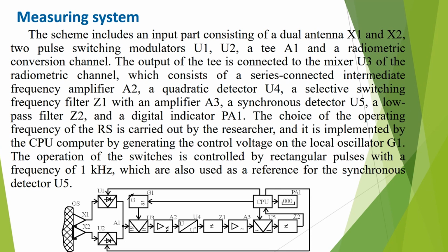The operation of the switches is controlled by rectangular pulses with a frequency of 1 kHz, which are also used as a reference for the synchronous detector U5.